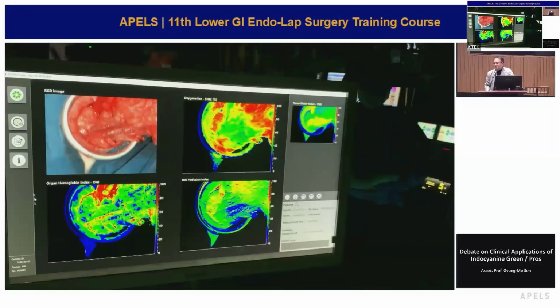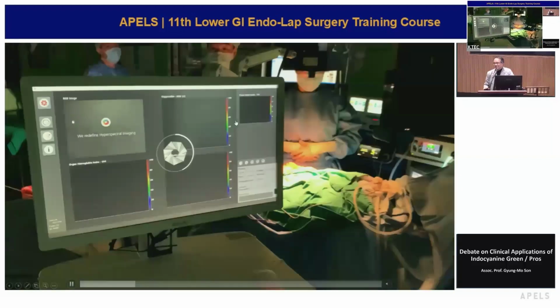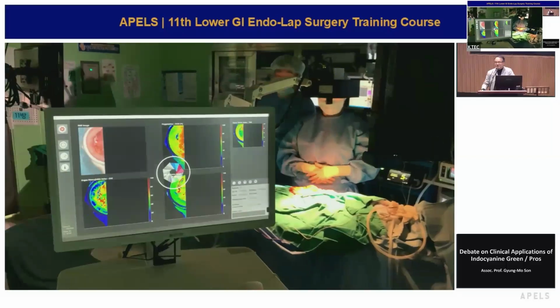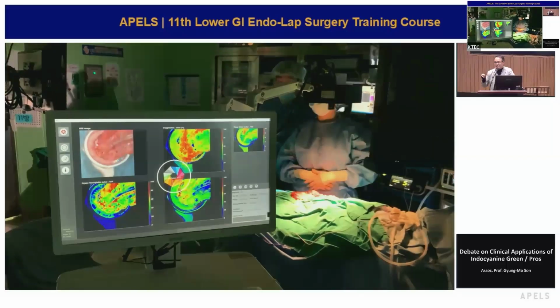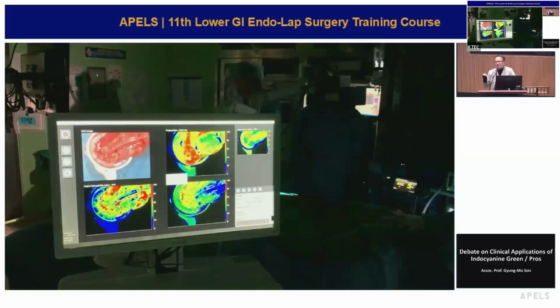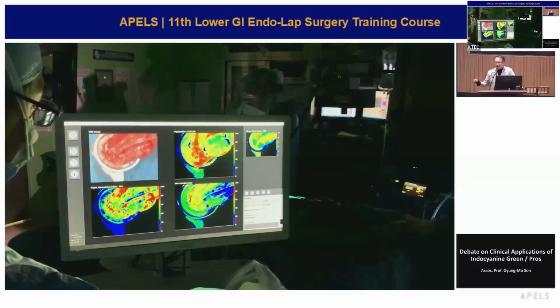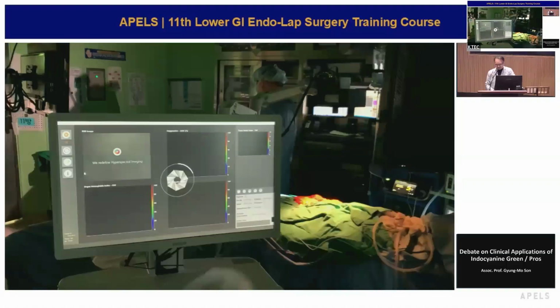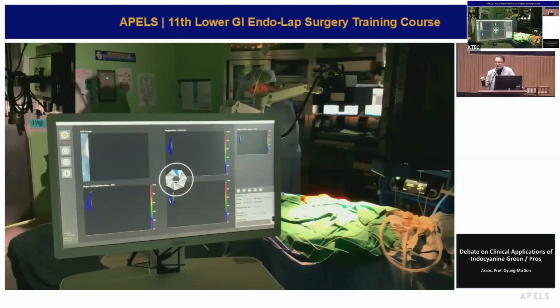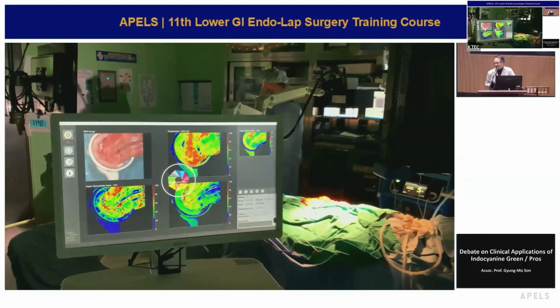This patient has almost 7 centimeters of ischemic change here. This hyperspectral system just uses light; it doesn't use a fluorescent material. It just uses the image, analyzes the spectrum, extracts the signal of oxygenated hemoglobin, analyzes the data and expresses the color map like this. It just needs 15 seconds for detecting, analyzing and expressing the data. So very fast, very easy.